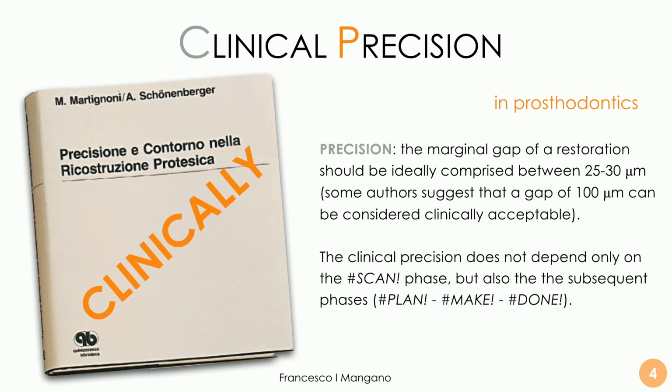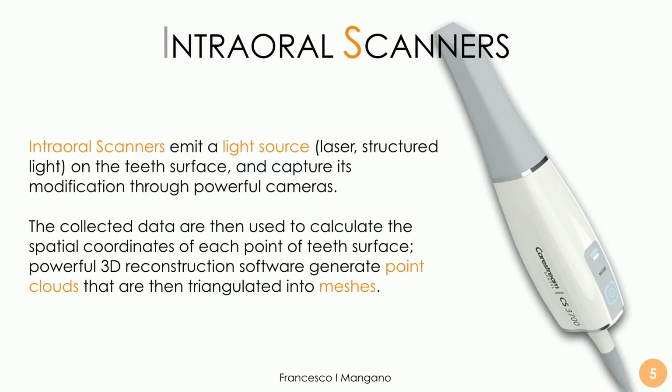But anyway, we need to consider that this definition is very clinical, and depends on the 4 phases that I have mentioned before: the scan phase, but also the plan phase, and how we manufacture our restoration, and how we cement our restoration. So the 4 phases determine this clinical precision at the end. And when we talk about an intraoral scanner, it's totally different, because precision has a different meaning. It's more mathematical, and it refers only to the scanner and not to the full workflow.